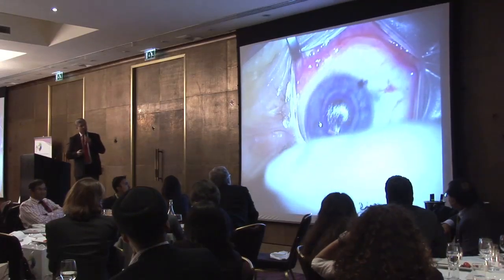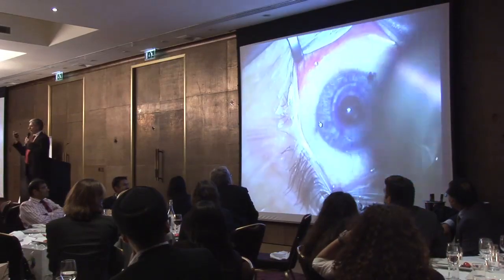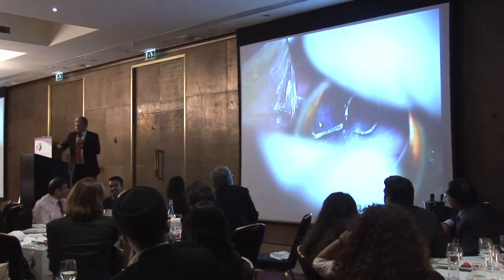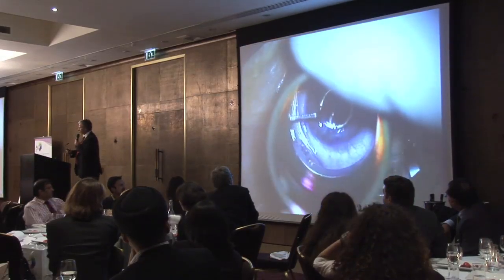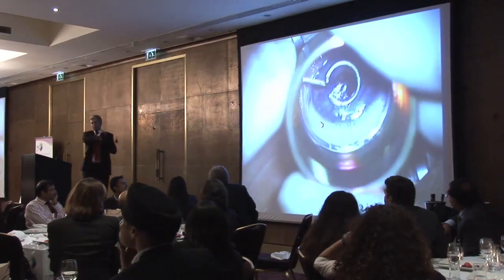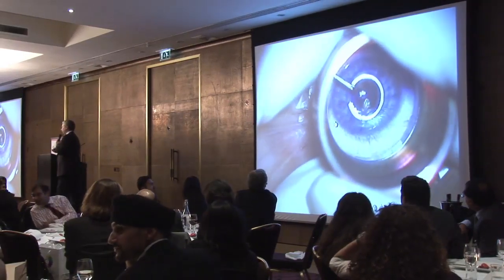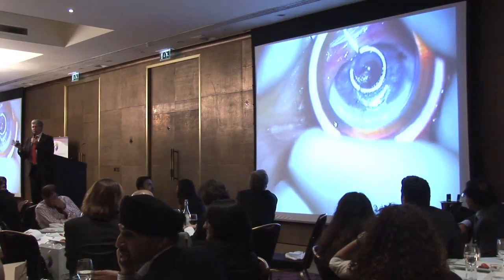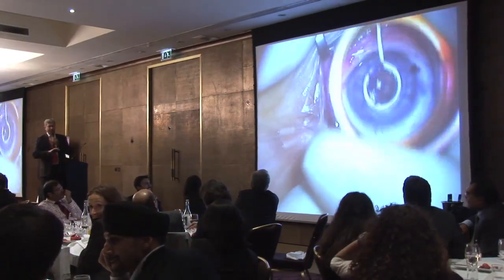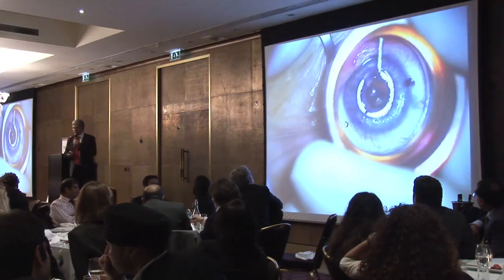This procedure is done mechanically. So there is a philosophical question: if you imagine what we do mechanically, we go in between the lamellae of the cornea. If we do femtosecond, we can actually cut a few of the lamellae. So the question is if we are not compromising a little bit the biomechanical stability. But there are some studies showing that actually the results, femtosecond and mechanical, are very similar. So femtosecond is of course more pleasant for the patient.